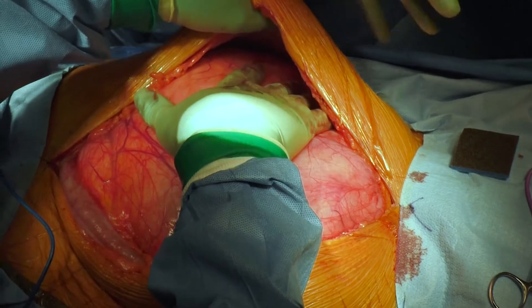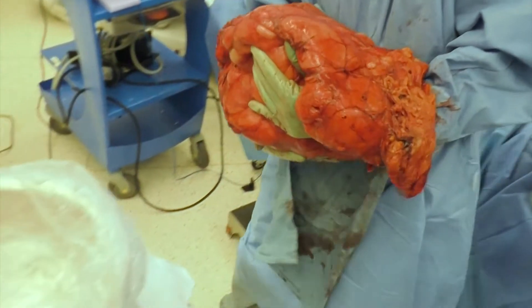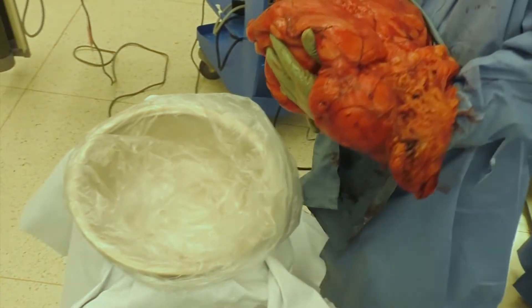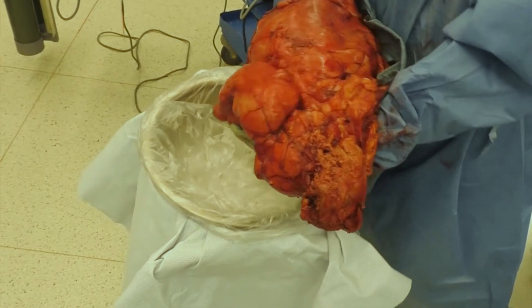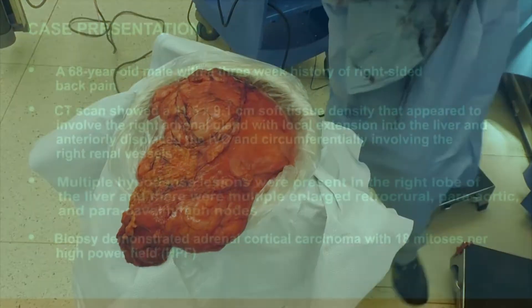Here's what surgeons saw during surgery. Using the 3D image guidance, the large tumor was removed successfully.